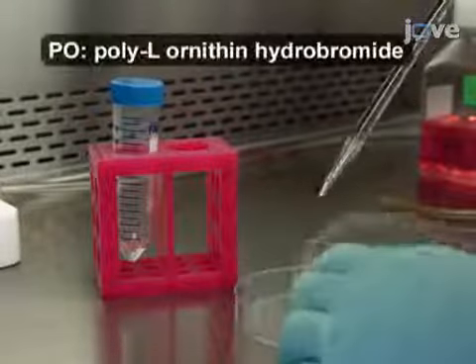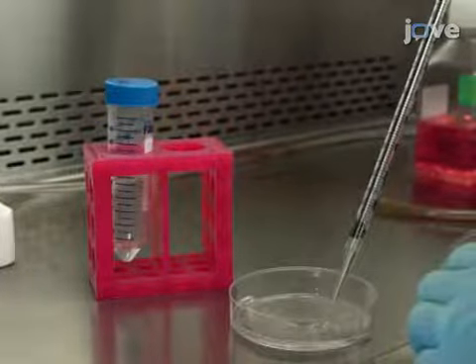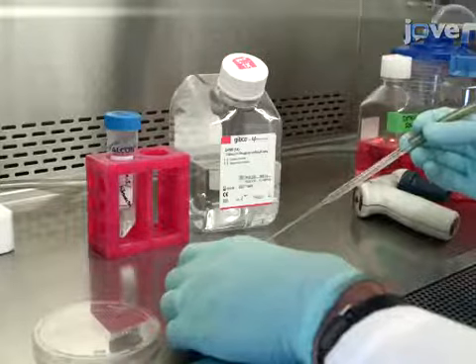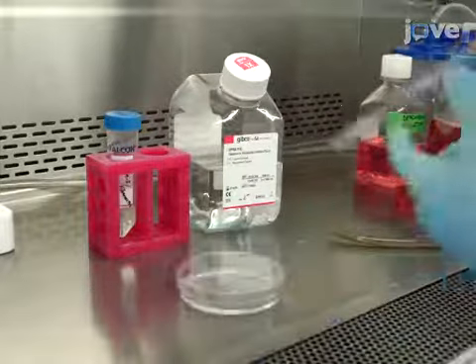Next, begin to prepare plates coated with PO, laminin, and fibronectin by first adding PBS containing 15 micrograms per milliliter PO to a culture dish. Then incubate the plates overnight at 37 degrees Celsius in a humidified incubator. Afterwards, aspirate the solution and wash the dishes 3 times with 1x PBS.